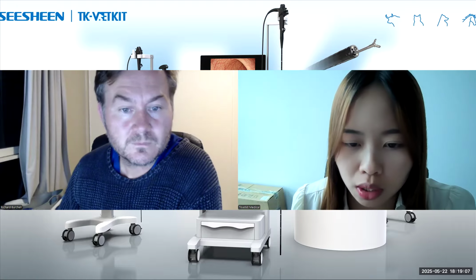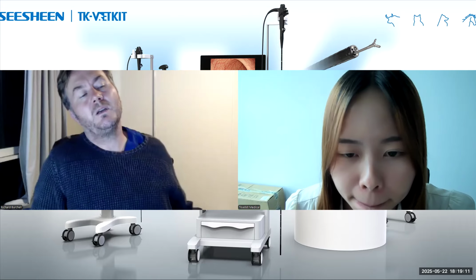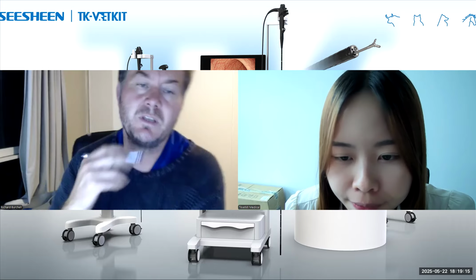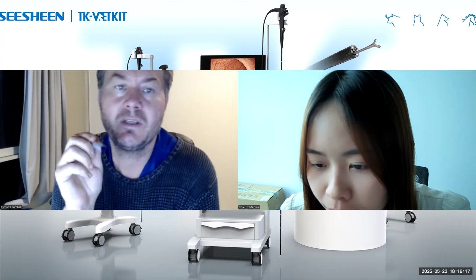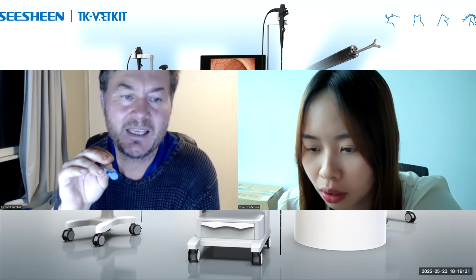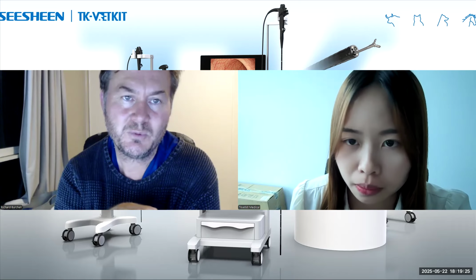Okay. Is it reliable if used through ETs with bronchoscope? If I understand the question correctly, the issue is that when you scope through the ET tube, you can't see the trachea that's under the ET tube.